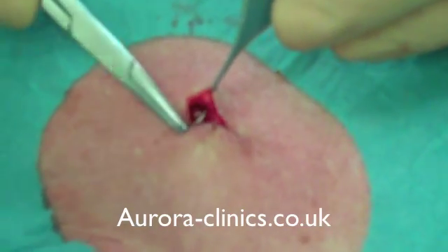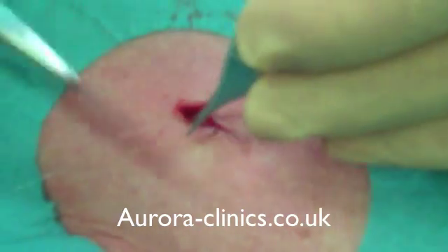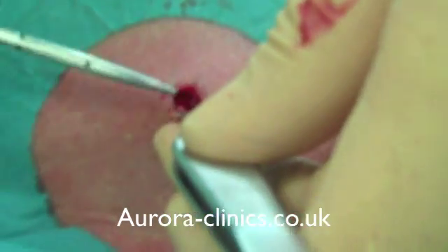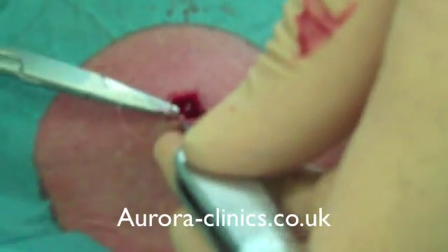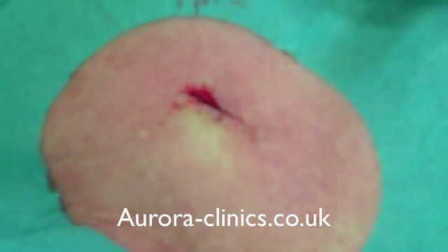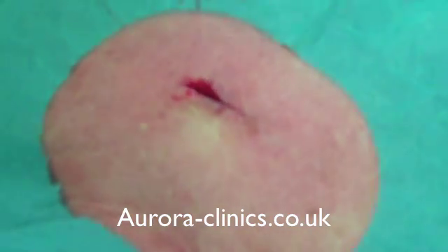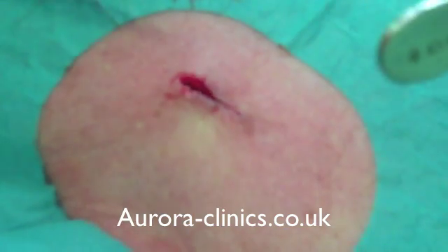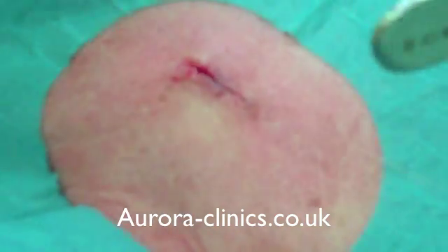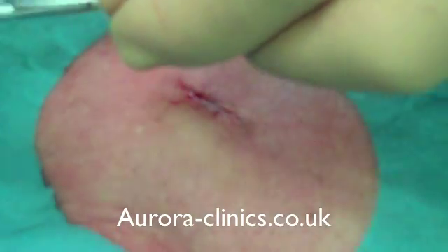I'll probably put two of them in — one there, one now. And that's enough, if done correctly, to take all the tension off the incision and have no tension on the skin. As I've mentioned before, it's the tension on the skin that causes poor scarring, so these stitches really do help avoid that.